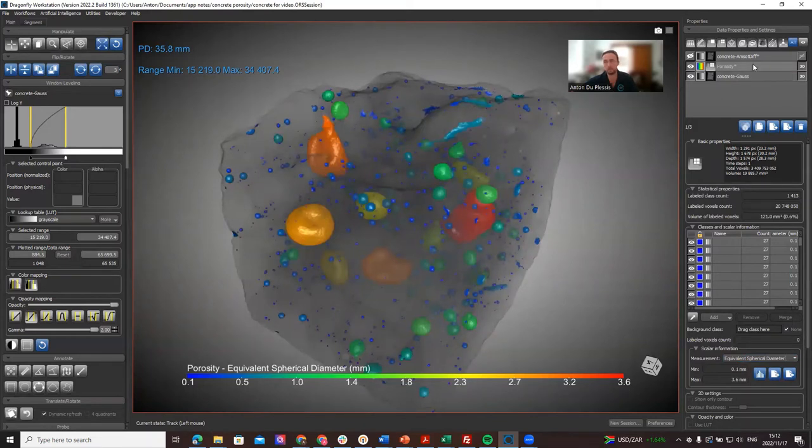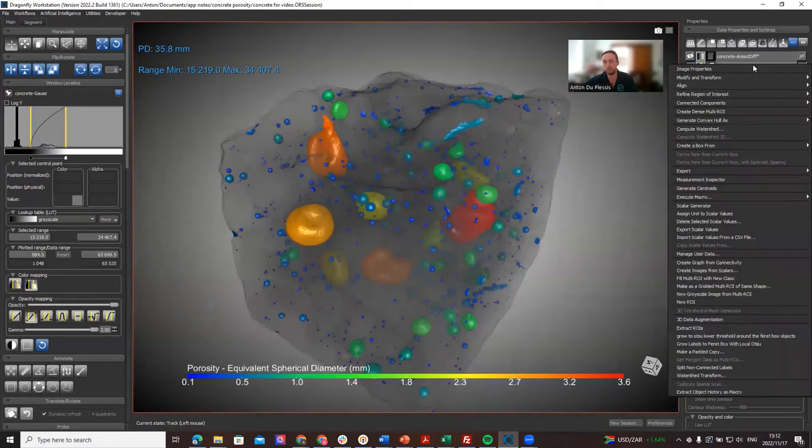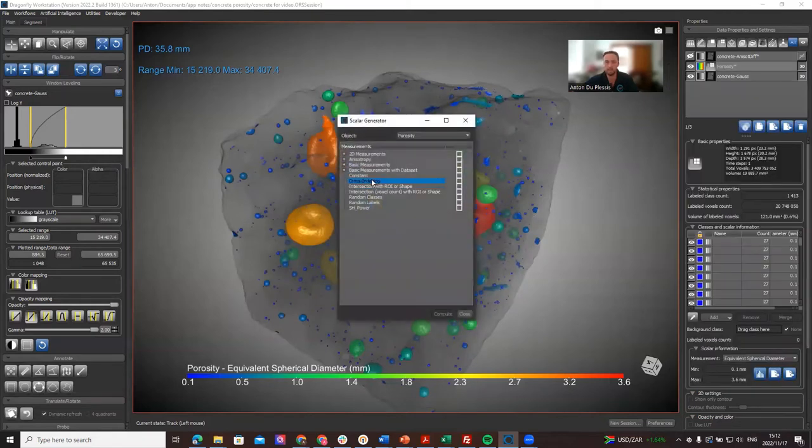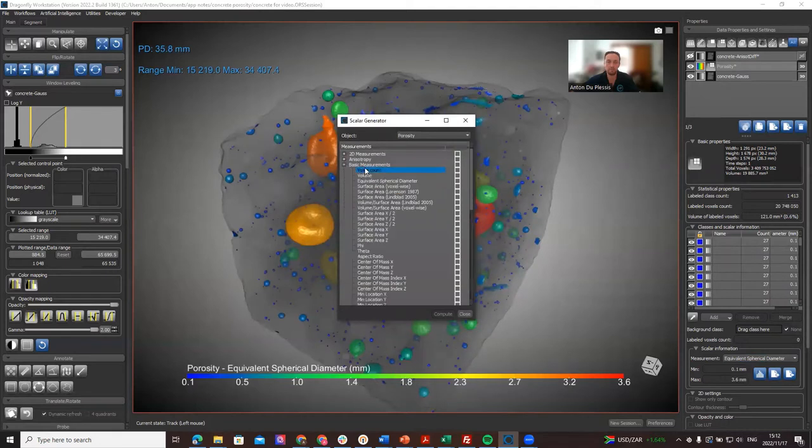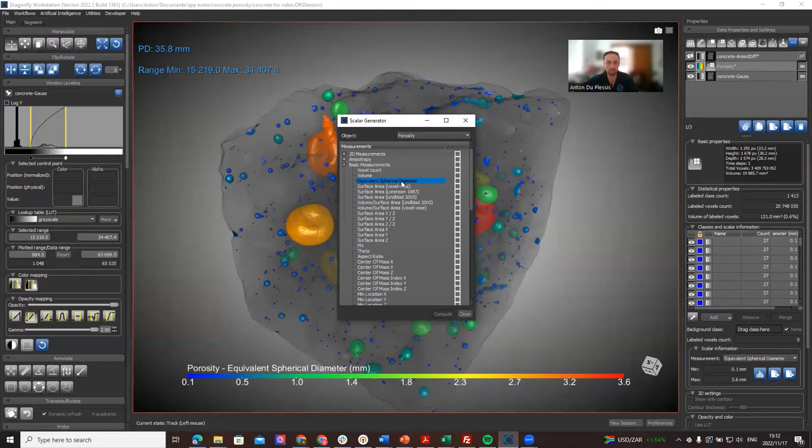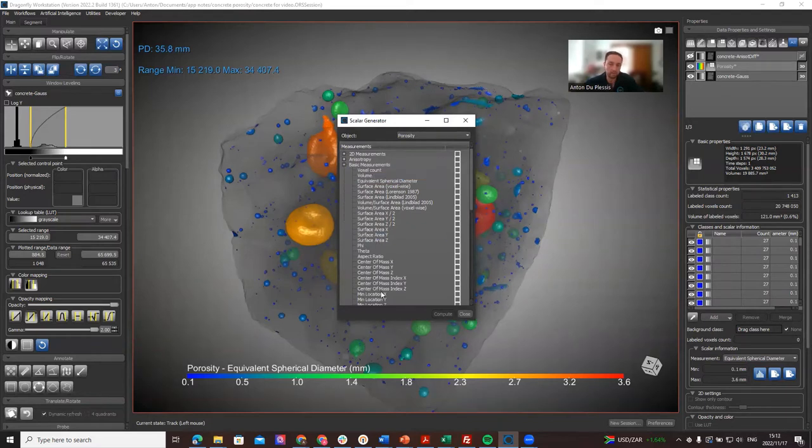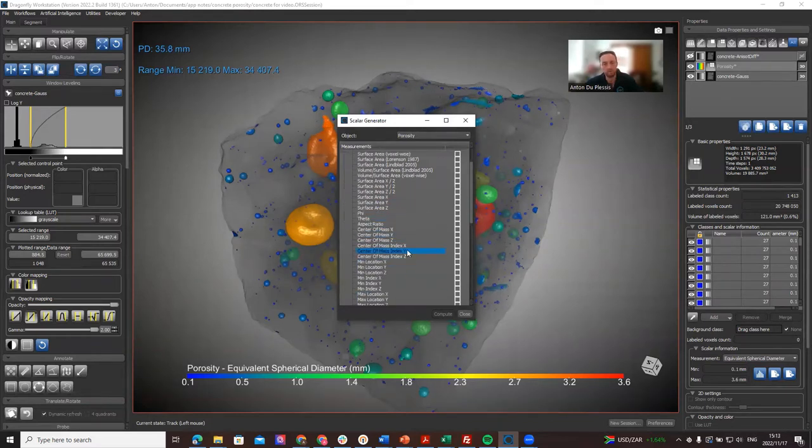How you reach it in the first place to calculate it is when you right-click on the multi-ROI and you go to scalar generator, under basic measurements, right under volume there's a new equivalent spherical diameter. The reason for this is it's a very fast calculation. It's calculating the diameter of a perfect sphere of the same volume as your pore or defect, and that is very fast and useful for regular quick analysis.